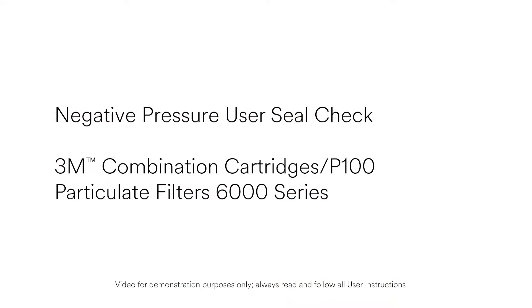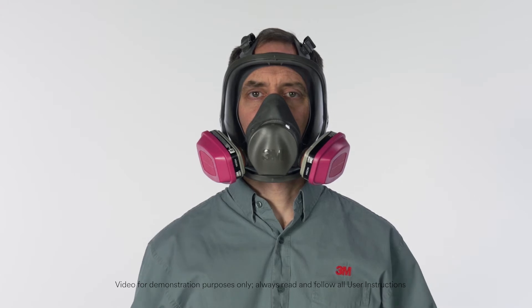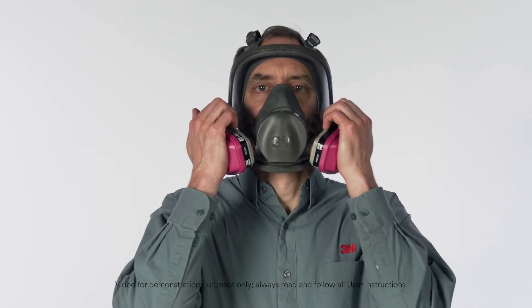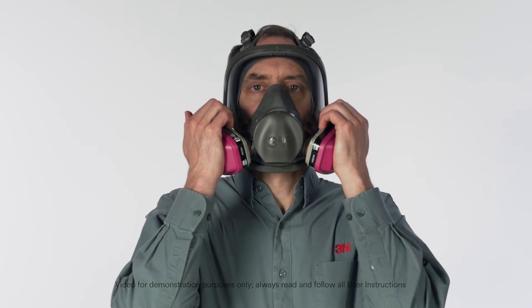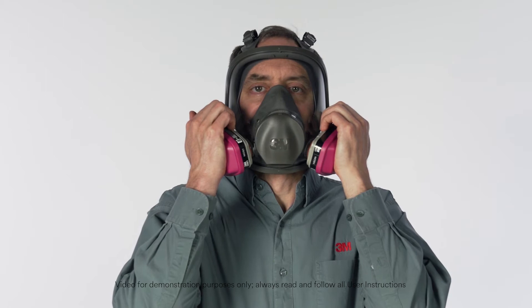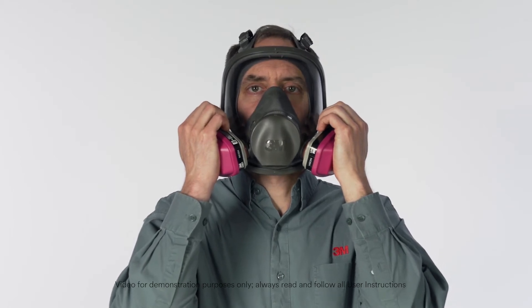To perform a negative pressure user seal check with 3M Combination Cartridges P100 Particulate Filters 6000 Series, cover the open area of the cartridge with the palms of your hands. After you've sealed the cartridge inlet, inhale gently. If the facepiece collapses slightly and you feel no air leaking between your face and the face seal, your respirator has sealed properly to your face.